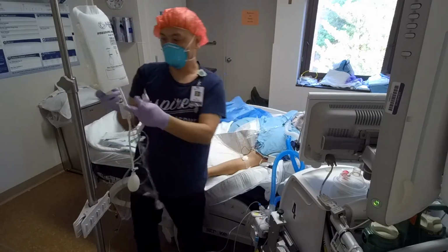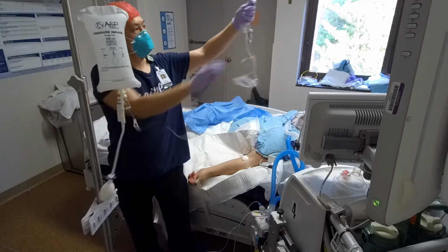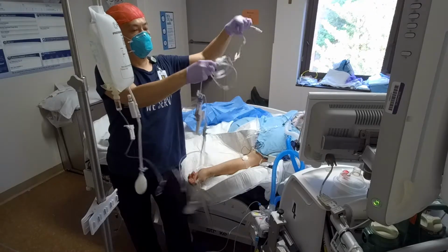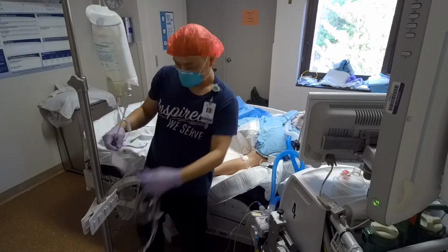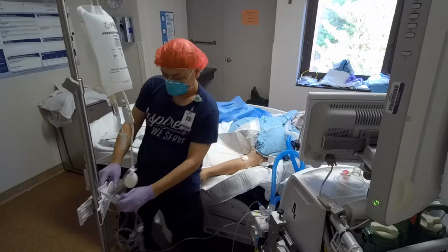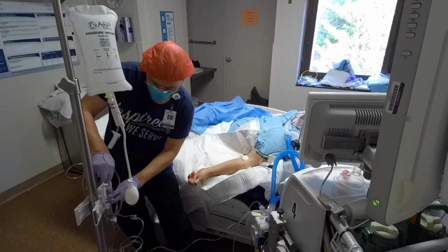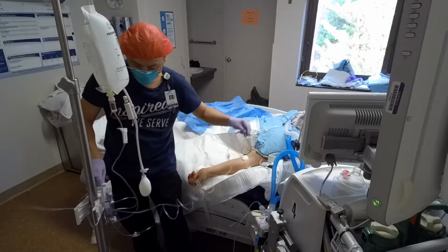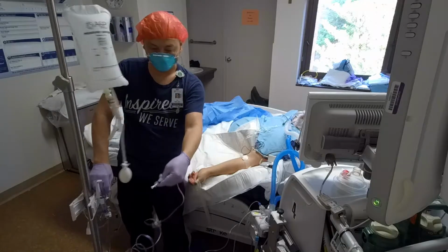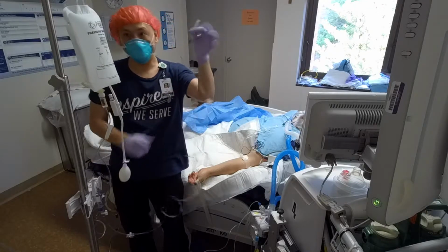This part, I'm going to the bag. All this stuff is going in here. Just the transducer. That's gonna have to be level, okay? Now we just have to prime it, alright? So let's pull the pigtail. Get all the bubbles out. Pull the air out. Now that's primed.